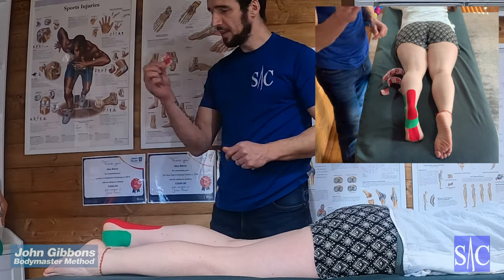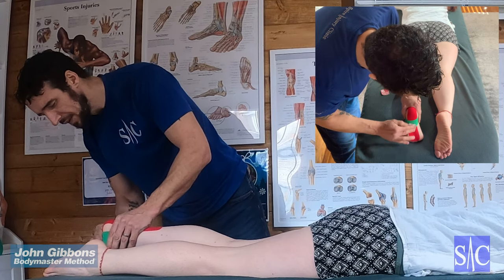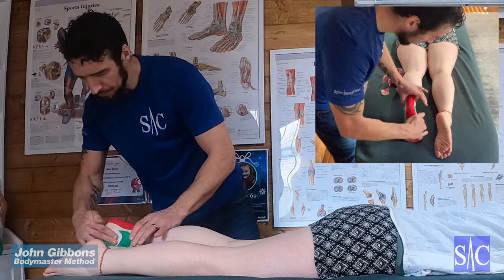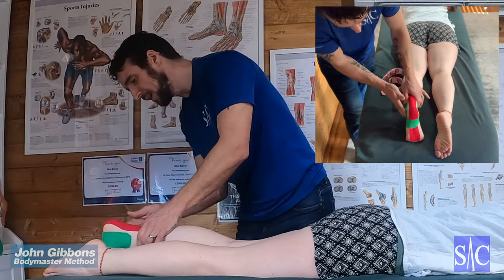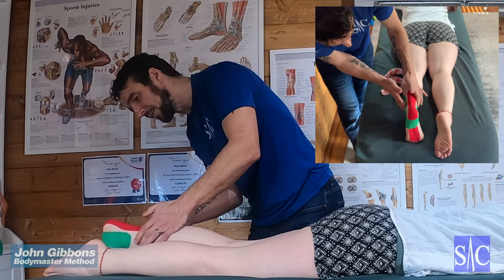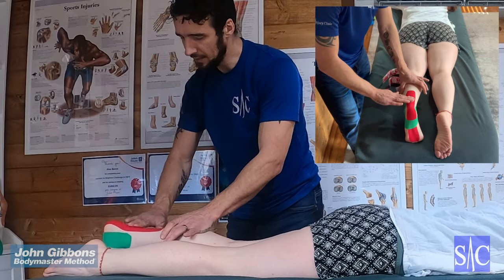Take the printed side of the backing and rub down to activate the heat-activated glue. This should last about three days or so of foot taping. If you have standing water in the shower, which tends to get under the tape and lift it off, you can still get two to three days easily. Any itchiness, remove it.